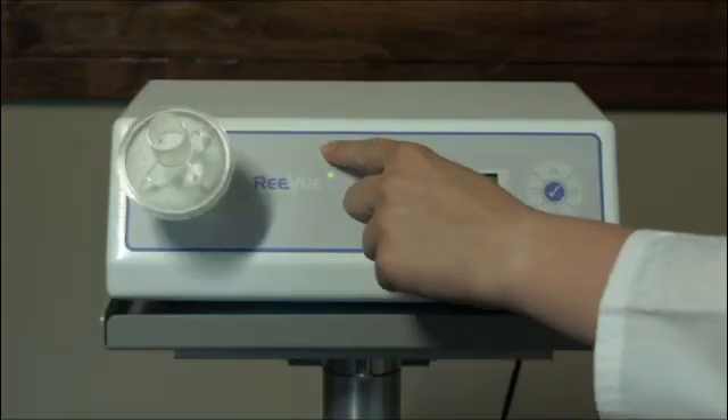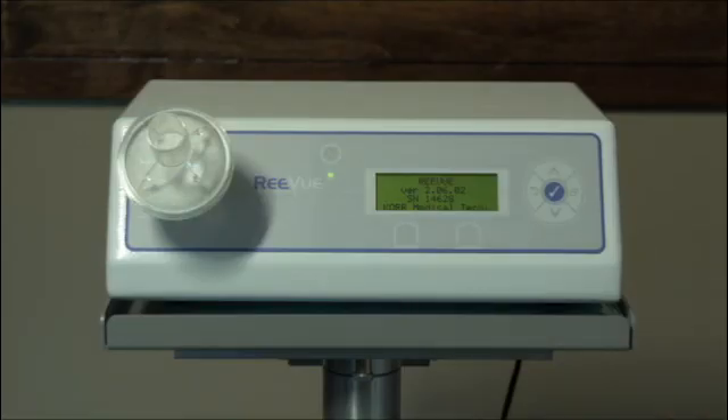Operating the ReeVue is incredibly easy. Once turned on, it runs through a self-calibration cycle. Make sure that no filter or metabreather is covering the intake port during this cycle.